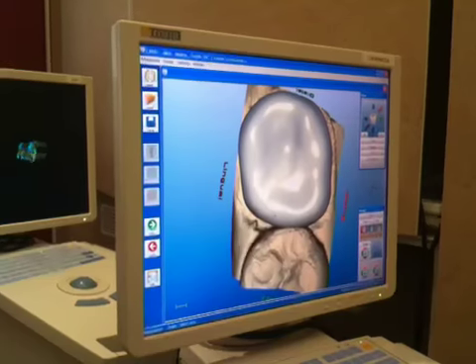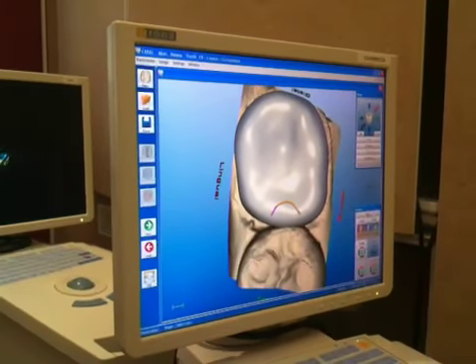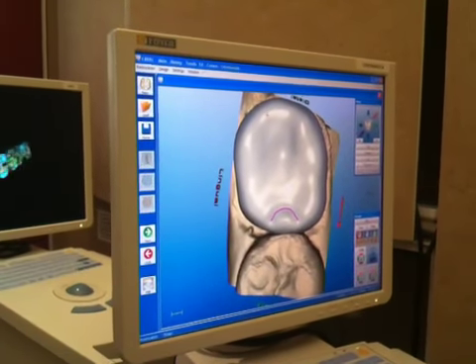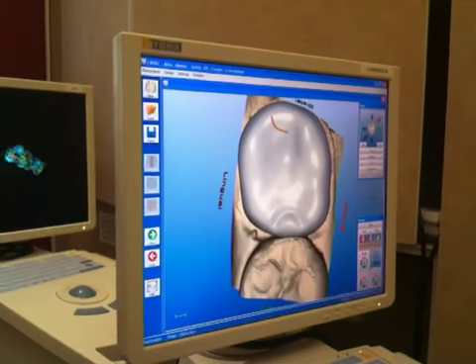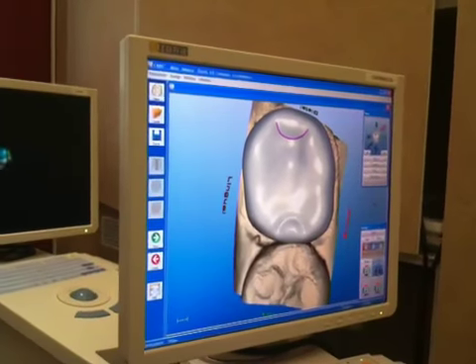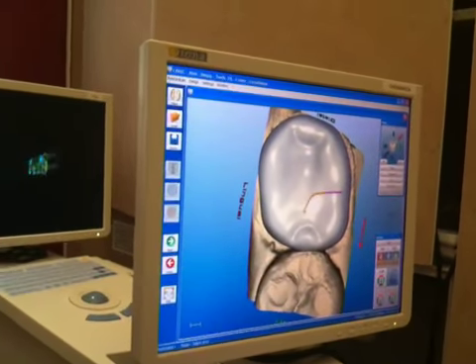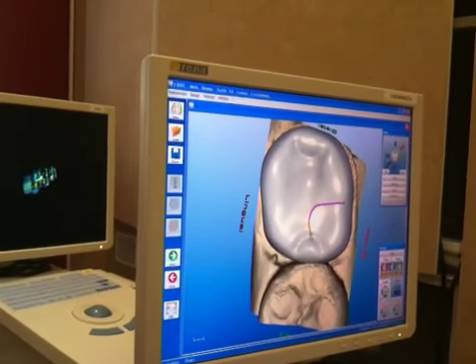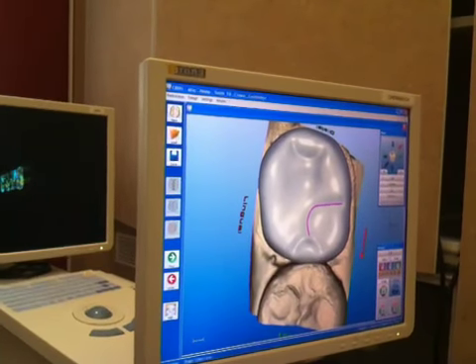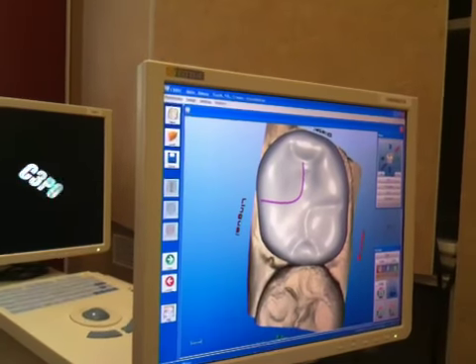So what we're going to do now is where those years of molding teeth come into practice. And we're going to come in here and we're going to drop in where anatomy should be. By anatomy, you mean shaping of the surface of the tooth where it impacts the tooth above it and so forth. And the food, yeah. Exactly. A natural molar like this will have anywhere between 4 and 5 cusps. And so we want to just make it look like it has those 4 or 5 cusps.